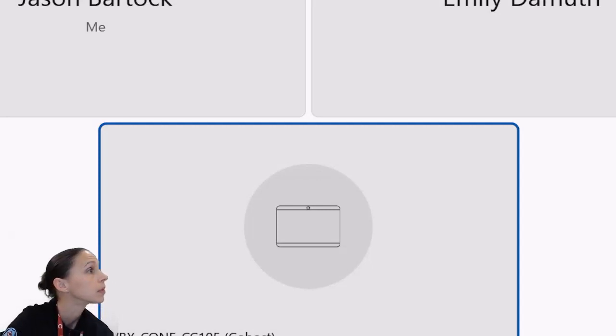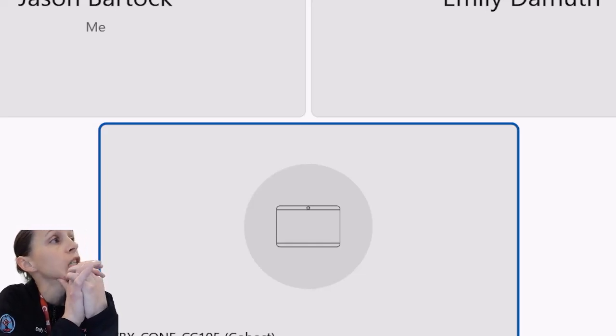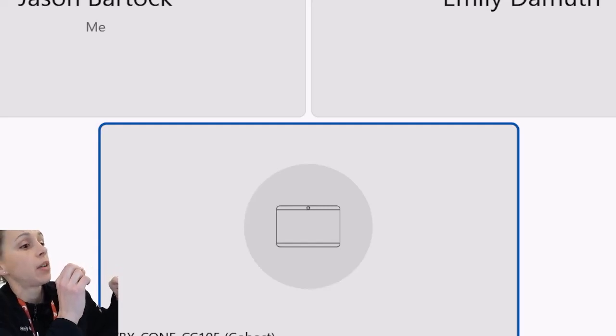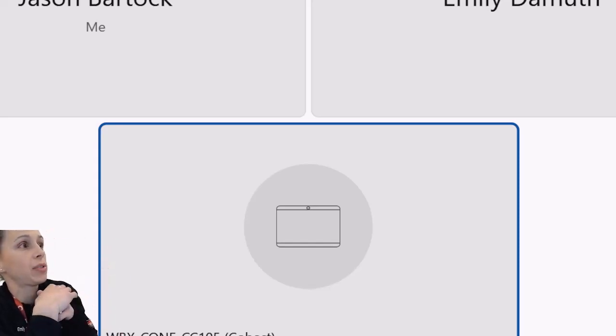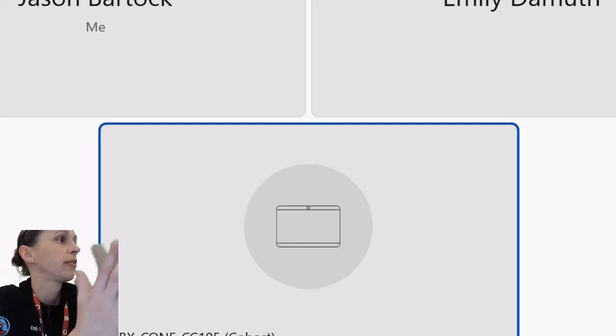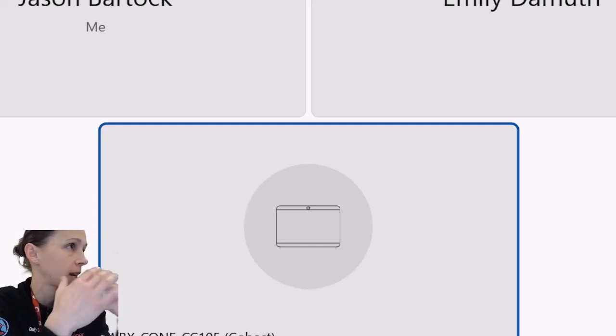Is there a certain time that they have to be on where you do a circuit change, or does it just happen in certain scenarios like the ones you brought up? I've never had a patient get a circuit change. With VV patients, it's usually a little easier. You can draw a blood gas from post-oxygenator, so you'd expect a really high PaO2, like 300 or 400, and if you're seeing levels less than 150, then unless there's a sudden thrombosis event, you creep towards needing a circuit change, and we have more leeway in that decision.